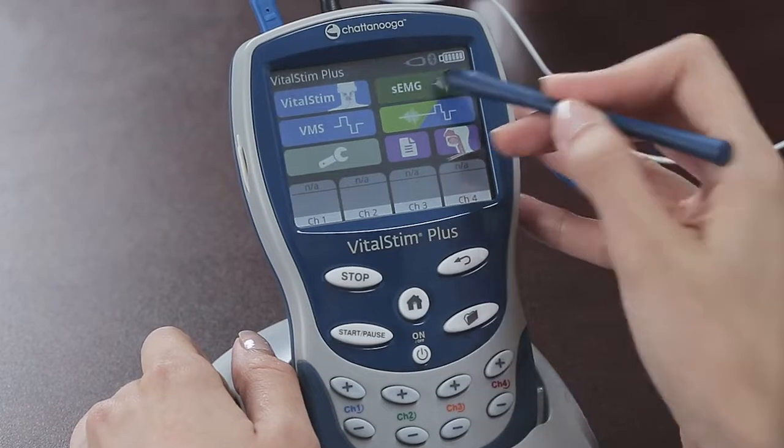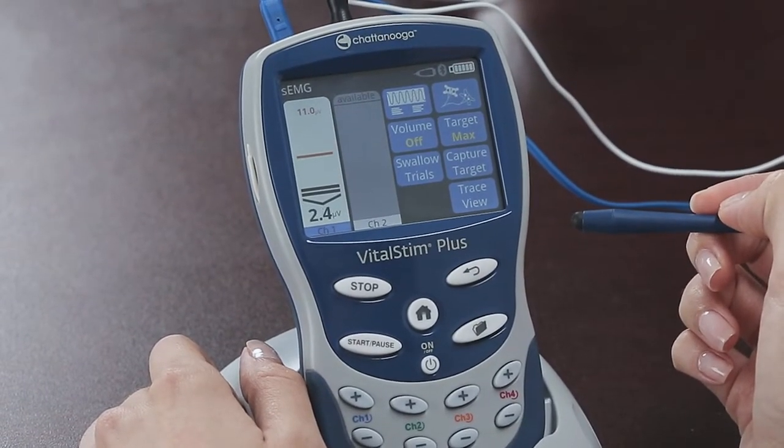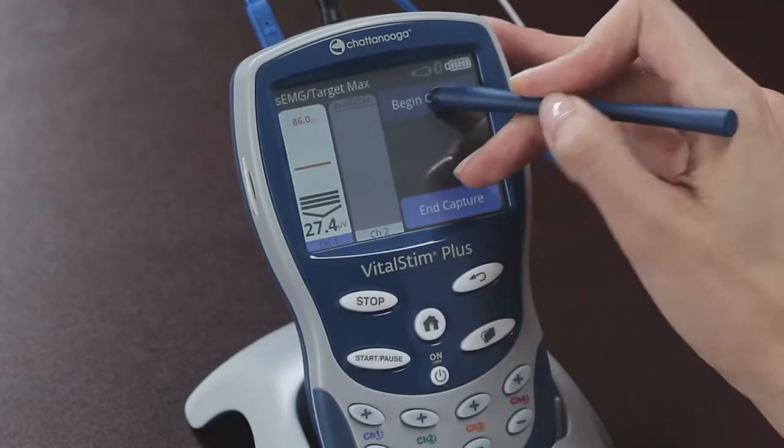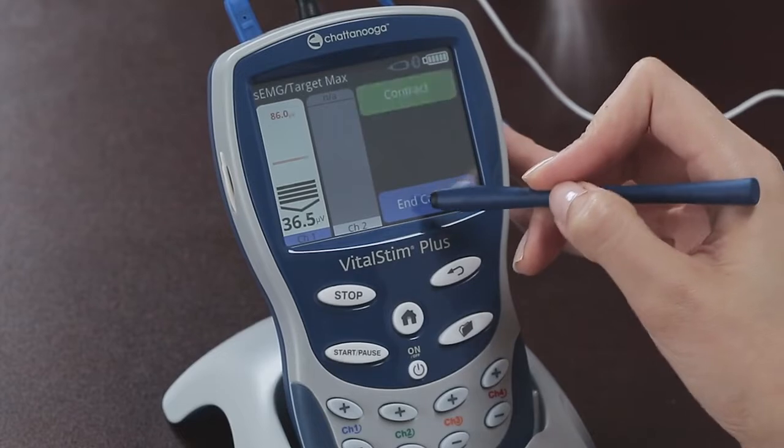Let's do this. Make sure the recording electrodes are connected to channel 1 and that channel 1 is highlighted on the screen. Also make sure that the reference electrode is connected somewhere nearby on the body. Now press begin capture and ask the patient to perform a couple of contractions. Press end capture when you are satisfied with the effort.